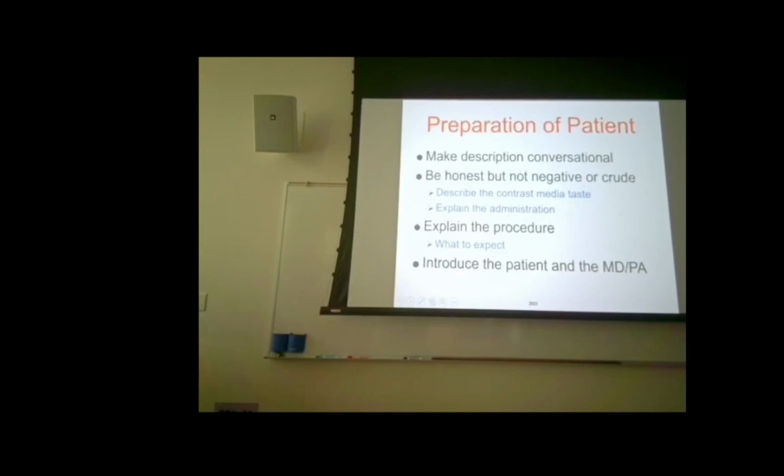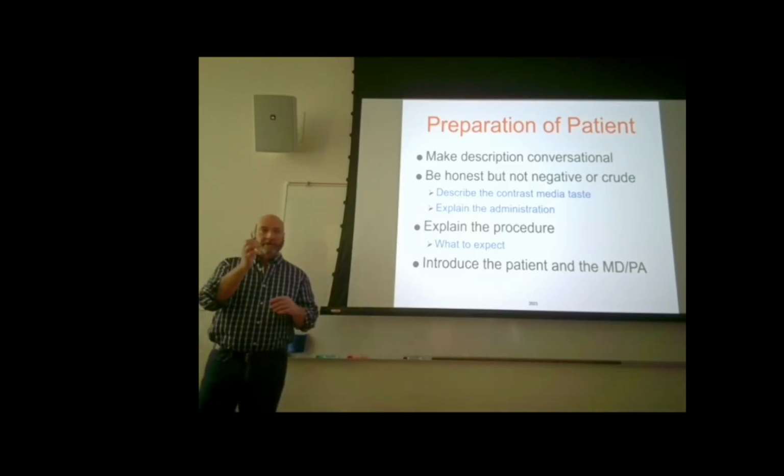So describe the contrast to the patient. Don't lie to them. Don't say it's really not all that bad. It's every bit that bad, right? Especially the iodinated contrast, just tell them it's pretty bad. One thing I can say is that whenever you order barium, you'll get with the barium straws that look like oxygen tubing that are a little bit bigger than this Sharpie.